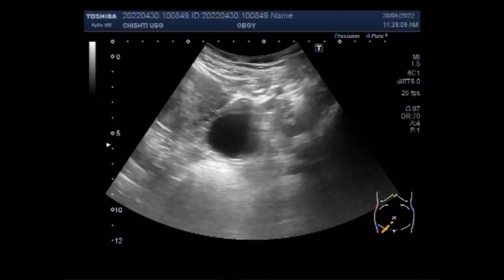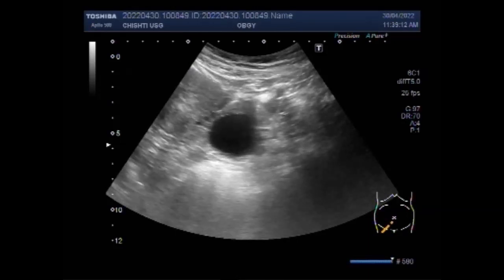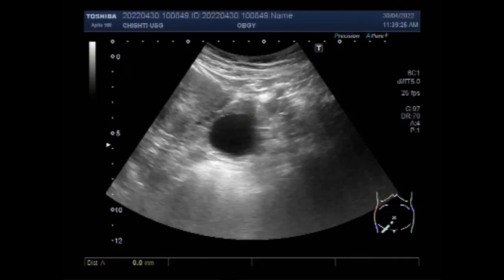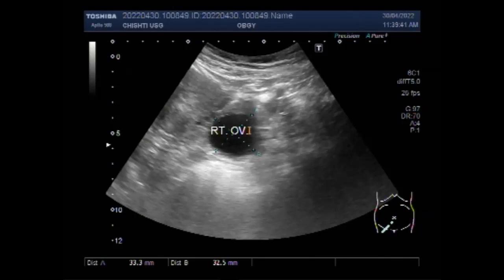Again, you can see the right ovarian cyst. The cyst is round to oval in shape and no significant turbidity is seen in the fluid. The ovarian cyst measures about 3.3 x 3.3 x 3.3 cm, is round to oval in shape, and no bleeding is seen inside this cyst.